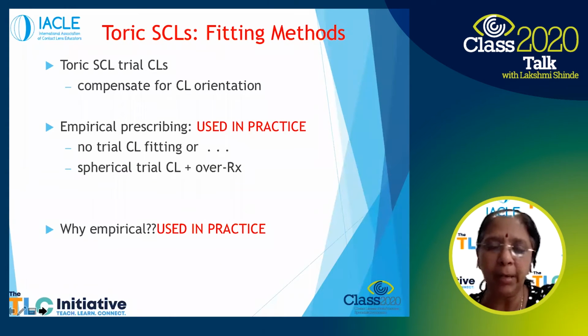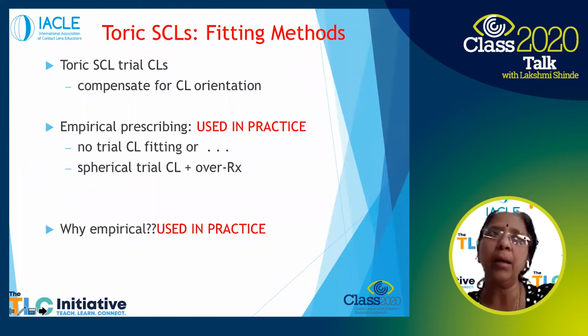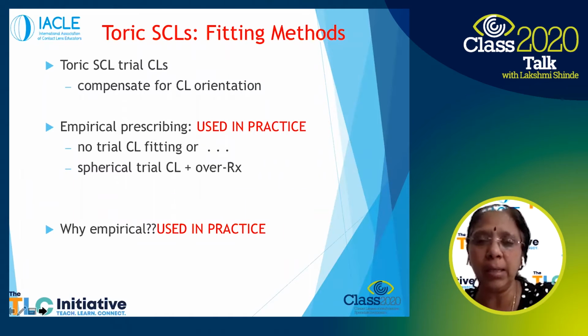So empirical fitting should be the norm. The reason being, even in India, there are certain practices which use trial lenses. And I really feel we need to get out from this mindset of using trial lenses, especially for torics, because now it is a very, very fast changing world and everybody wants service at the quickest.